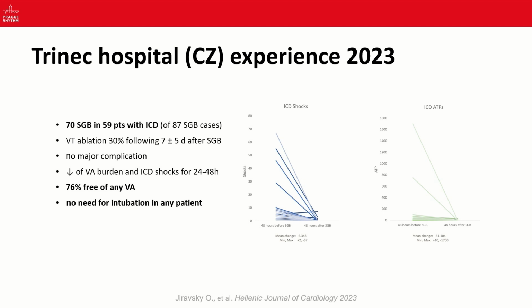More importantly, they reported that they did not need to intubate and sedate or perform deep sedation in any of these 59 patients. And based on their results, they suggested that this procedure may be used preventively to prevent intubation of the patients, whereas the previous reports used the procedure more as a bailout or in addition to sedation and intubation.